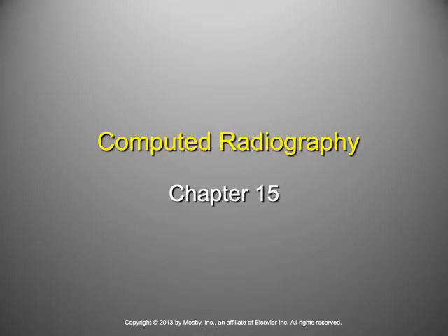There's a whole bunch of abbreviations in the chapter related to computed radiography. The really important ones are PSL, which means photostimulable luminescence.